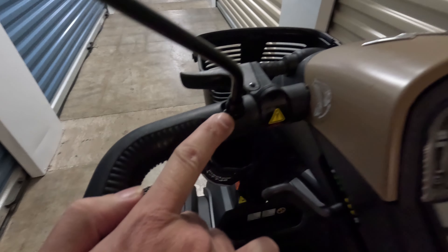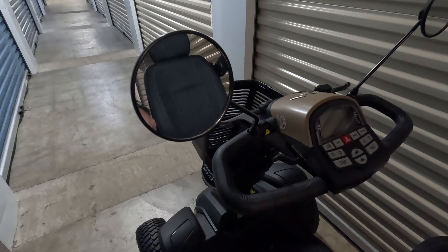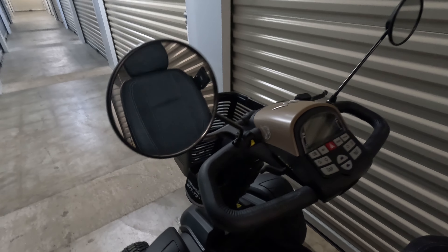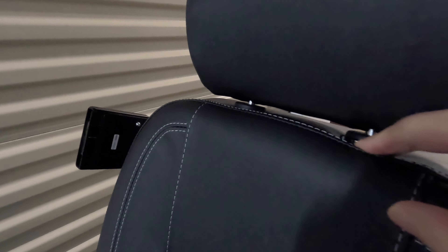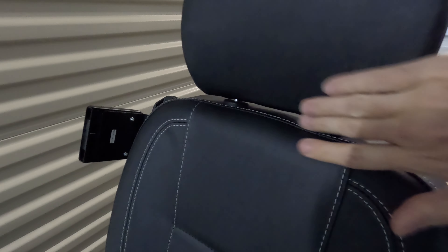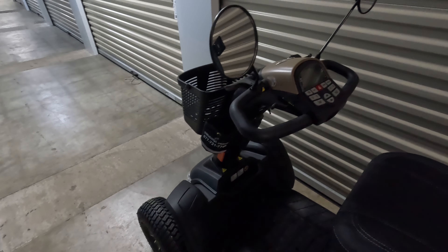You may notice a little difference in the mirrors. You get one mirror that comes with the scooter in the box, and the other mirror is separate — obviously a little different. The release for the headrest kind of flips around a little bit — not the most heavy duty of things.